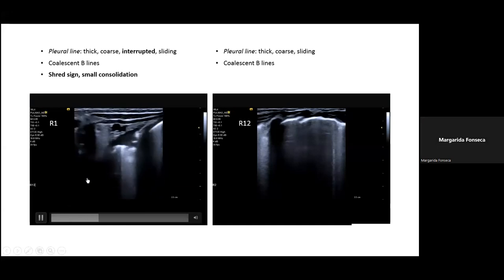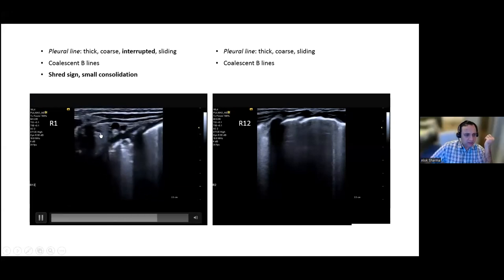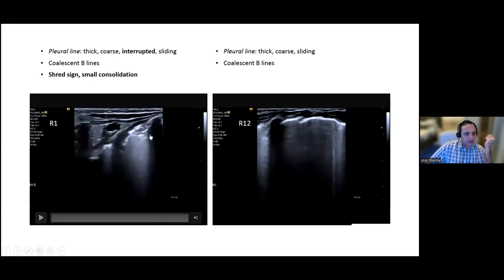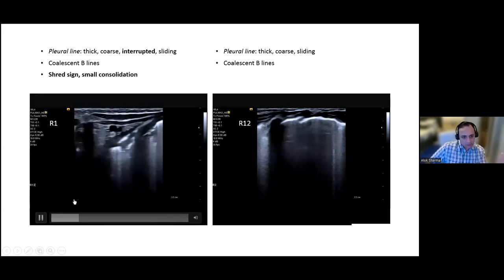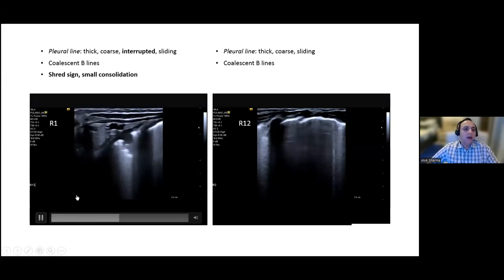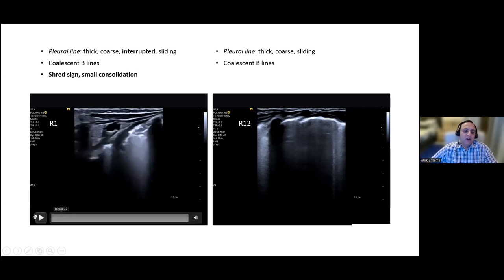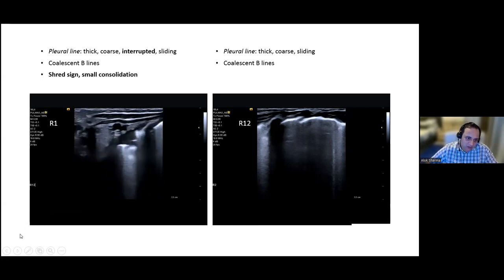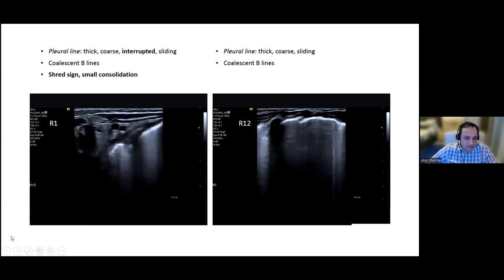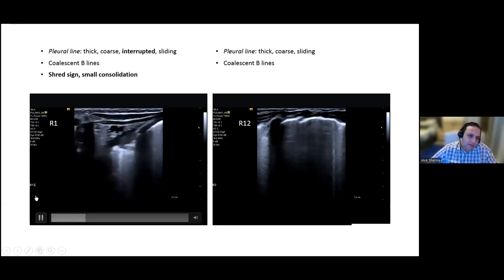You're in R1 at the moment. You've got thymus at the top, so what we're seeing is the upper half of the image. It's a beautiful image because you've got the thymus, a little bit of an effusion there, and a little bit of fluid around the thymic capsule. But yeah, I would agree that you've definitely got an irregular pleural line at the top. Now, the question from our perspective is, is that a shred sign or is that atelectasis? So what day of life are we?